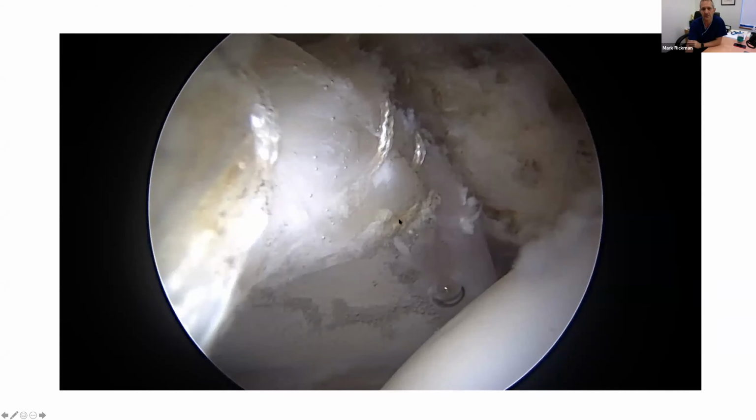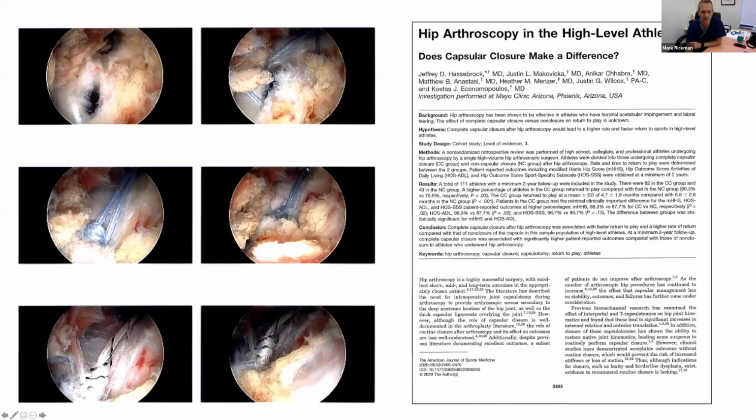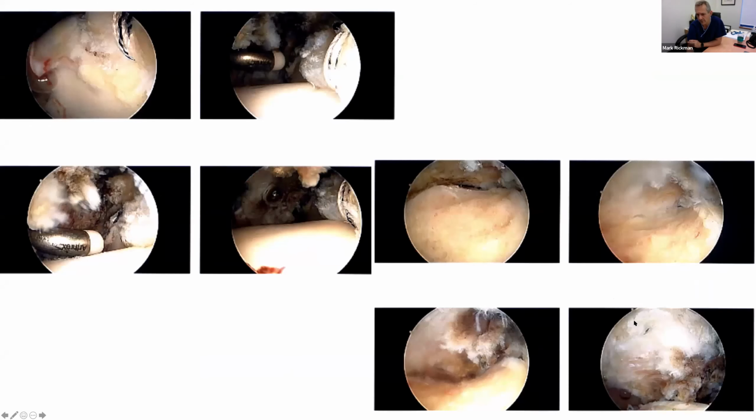And so in cases like this, you repair that back up, and here you can see the edge of the wave sign. So this articular cartilage was all folded down into the hip. And then you head off onto the outside and sequentially, so this is just flat. So you sequentially just burr that away so that you recreate a head neck junction. And that's a sort of typical thing. That just down there is the capsular repair.